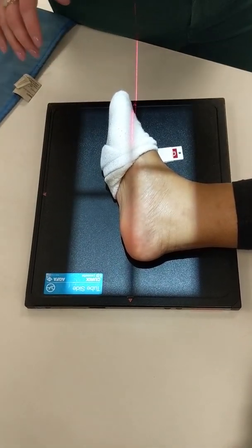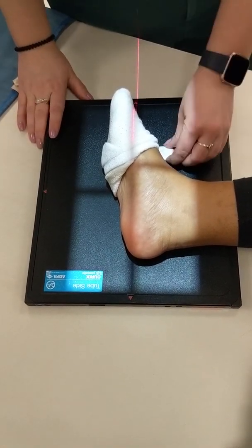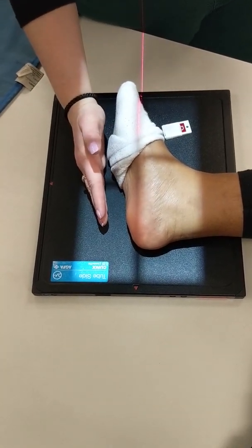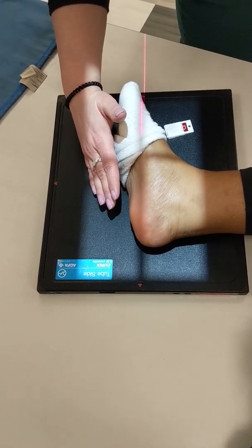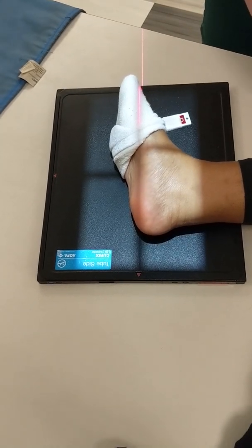Okay, make sure I did touch the universal button, so I'm going to check my SID again. Good. Okay, now her foot is dorsiflexed, but now we need to look at the plantar surface of her foot. If you notice, the plantar surface of her foot is a little angled like this. Now what I want to do is roll you up onto your affected side just a little bit more because I want to exaggerate this.